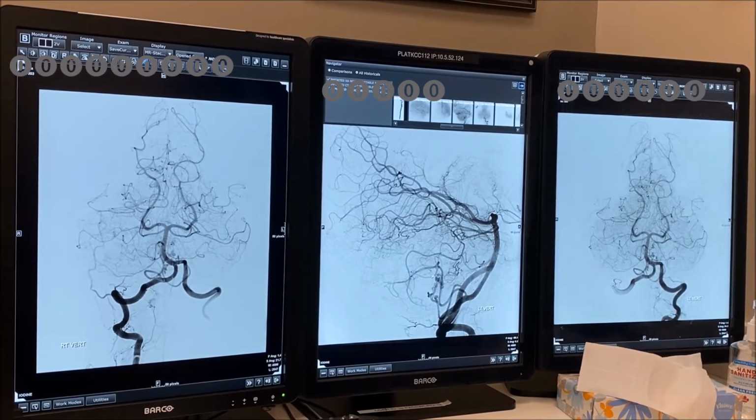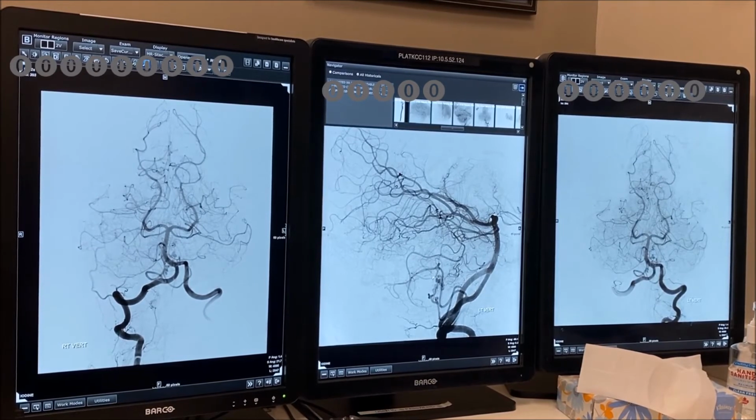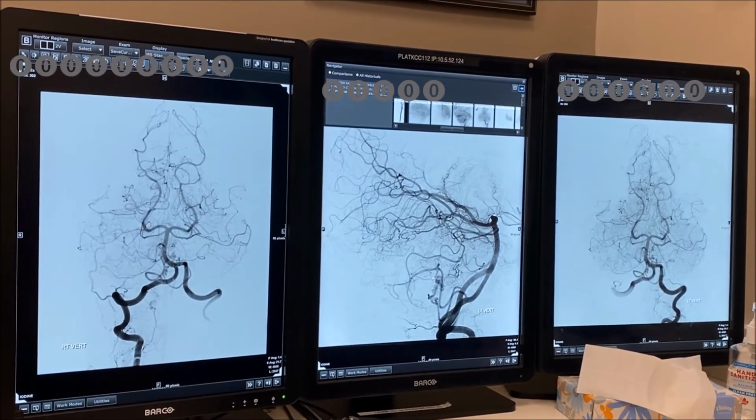How do we do that? Any ideas? To get a better understanding of the specific location. The location is good because the MRI is better than angio to tell you. MRI, yeah. No, it's something unusual, something different, something unconventional. Right? What would you do? You're the attending of the day. To see what deficits you'd create if you sacrifice the vessel, you mean?